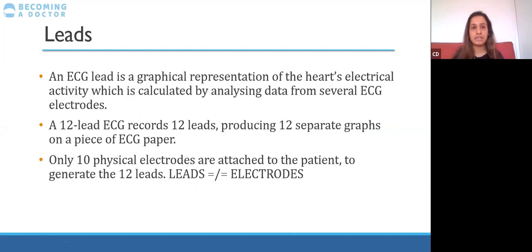So an ECG lead is a graphical representation of the heart's electrical activity, and that's calculated by analysing data from several different electrodes.